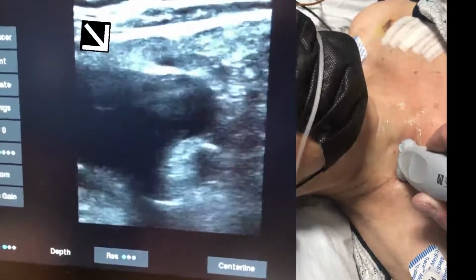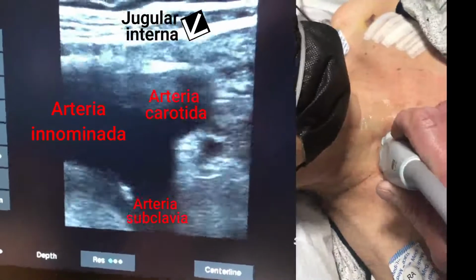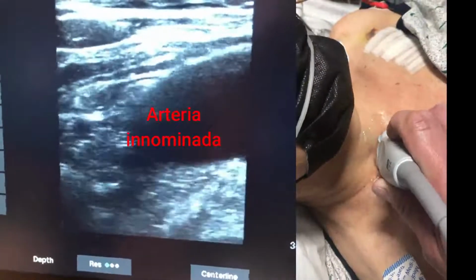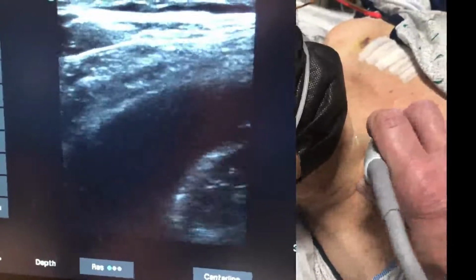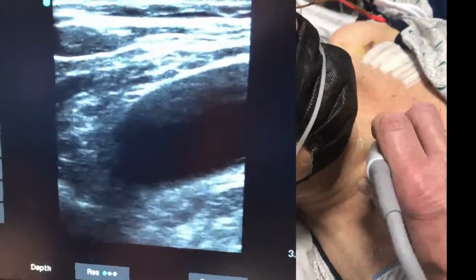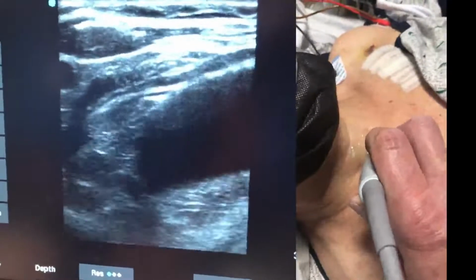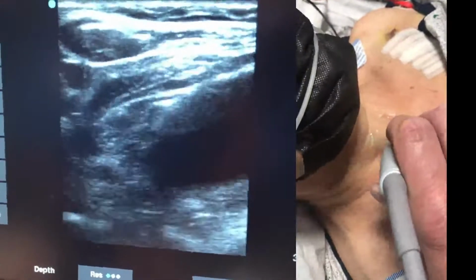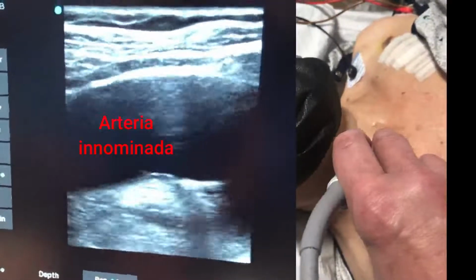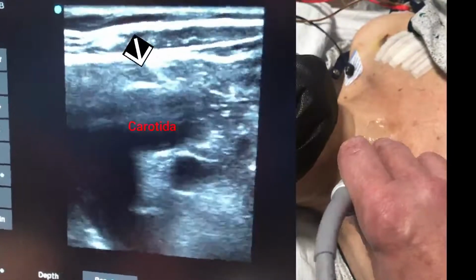So it's important to do a good anatomical scan on the patient. That way, we anticipate potential complications and risks, moving it again towards the suprasternal notch, following the innominate artery in this patient. And it's important, again, that physical examination and ultrasonography help decrease the potential risk of complications. I'm playing this video clip a little long because it is such an important case, and it shows how easy it is to make a mistake or have a complication.